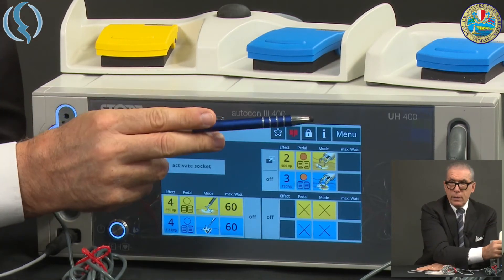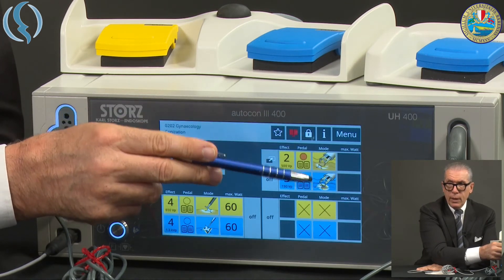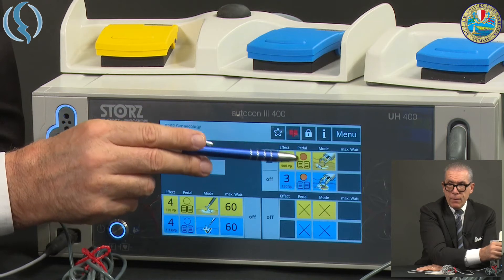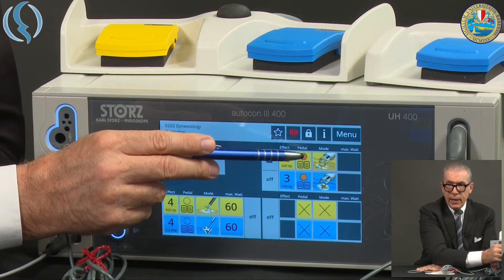The first one is an intelligent cable — it goes immediately into its menu. Here you can see very well. Then you have the choice of the pedal you can use. And here we are.